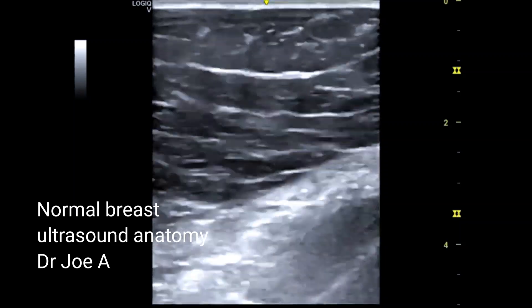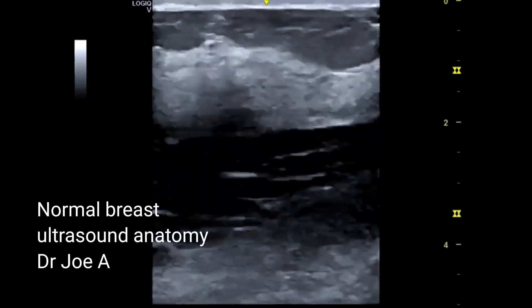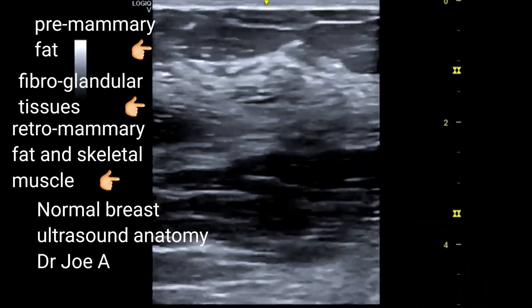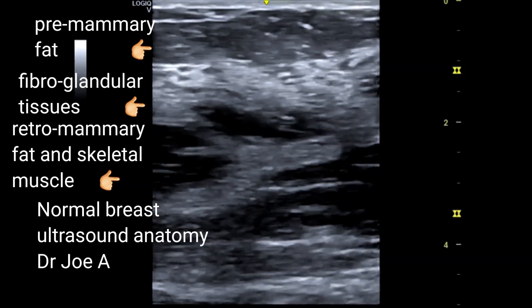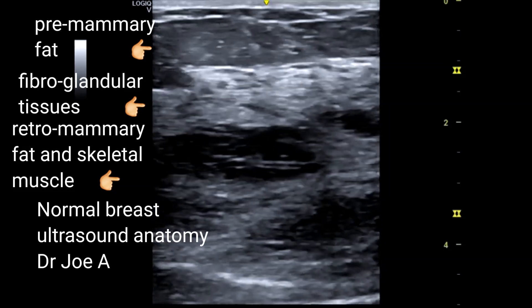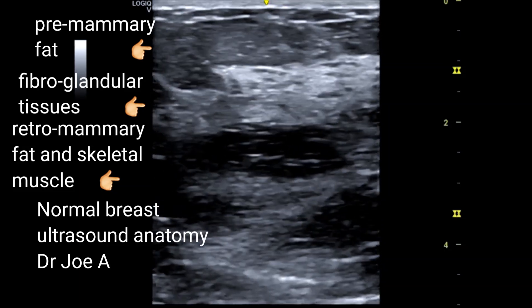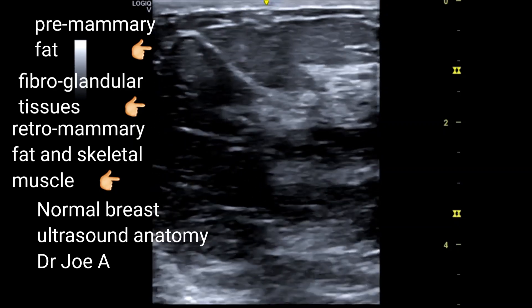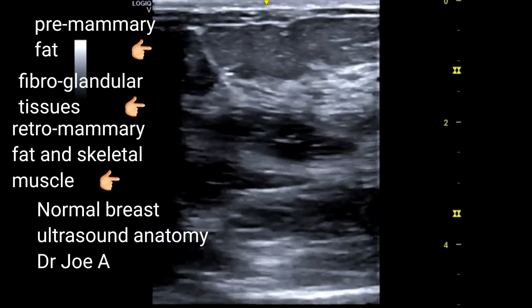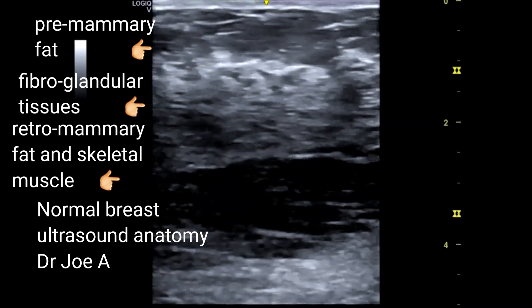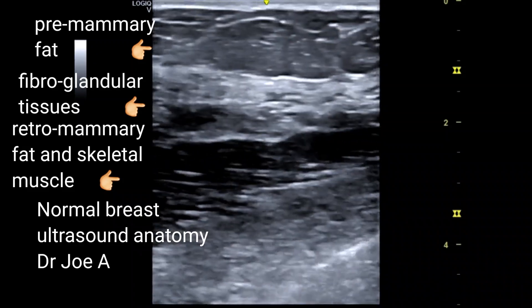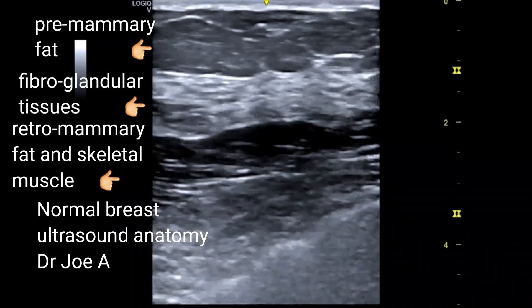Normal breast showing anterior or superficial skin and hypoechoic or darker pre-mammary fat tissue — this is quite prominent in this patient. Beneath that is the echogenic or brighter fibro-glandular tissue, containing fibrous tissue and mammary glands or breast milk-secreting breast lobules.